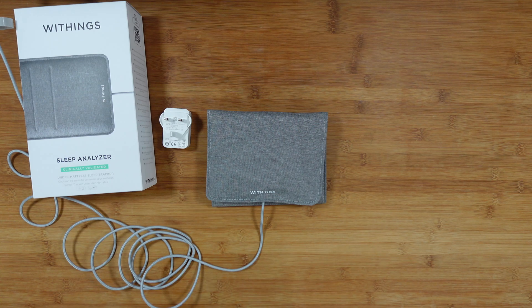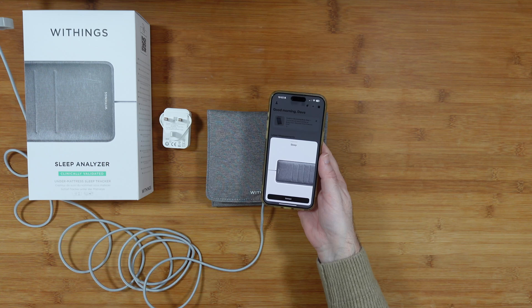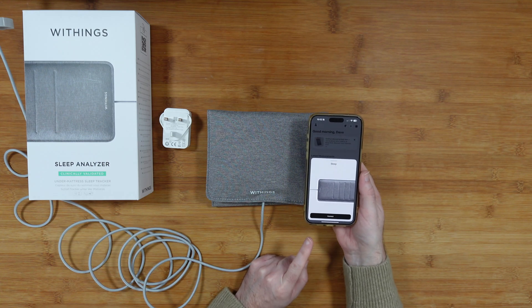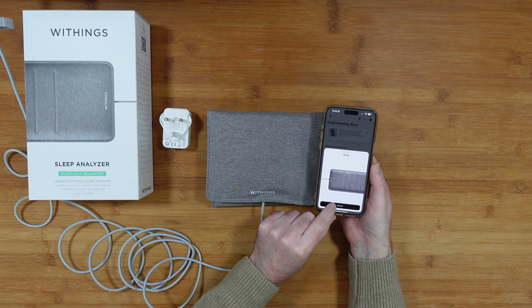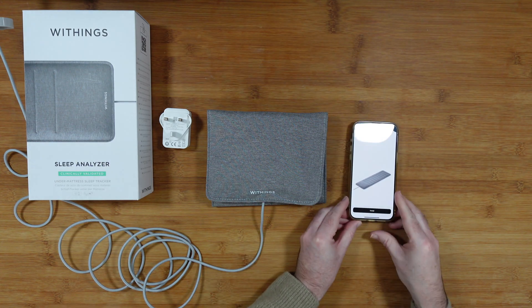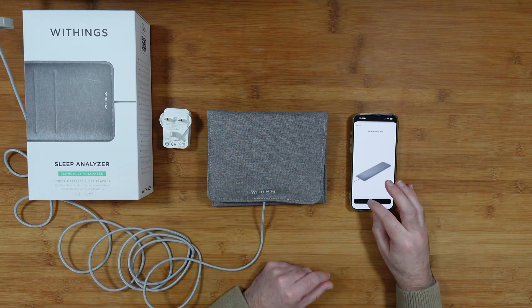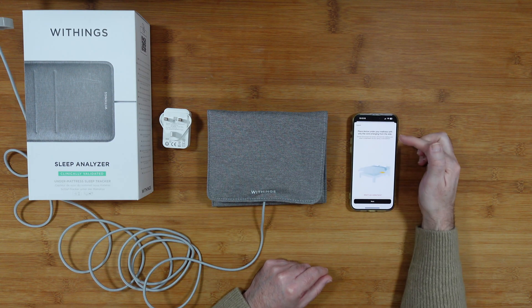We've plugged it in. Let's check the quick start guide to see if there's a power on/off button — there isn't one. While I was looking to my left, you can see it automatically turned on and appeared in my Withings app. I can now tap 'Connect' — it says 'Sensor detected.' So it appeared without me doing anything, which is great.